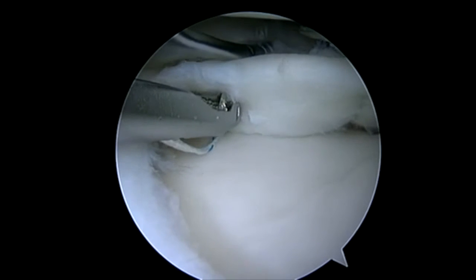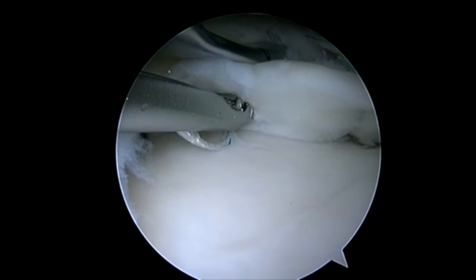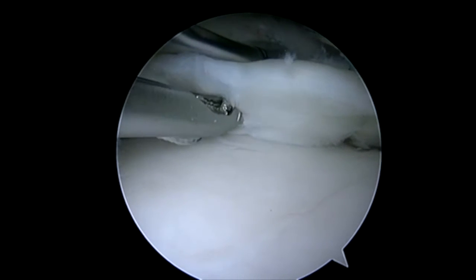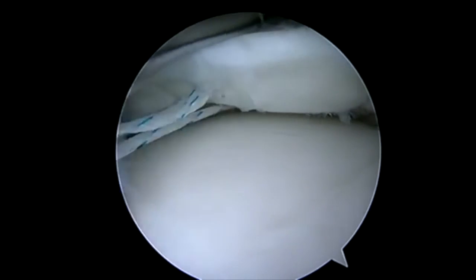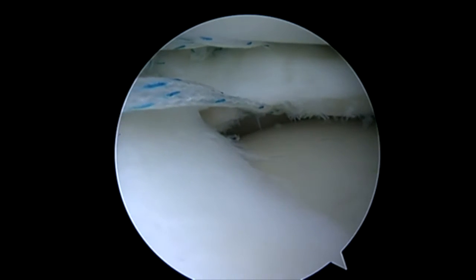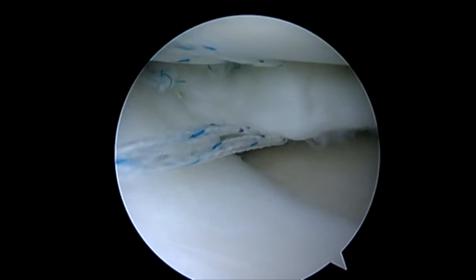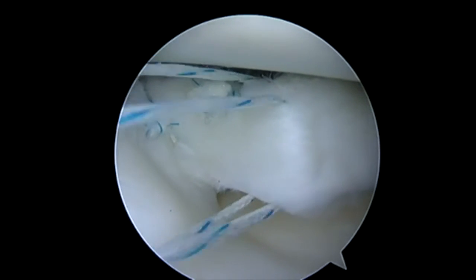I pass and tie each suture as I go. On this repair, sometimes I'll pass and use the initial suture as a traction suture. But in this case, the tear was just lined up very nicely and didn't require any extra manipulation of the meniscus to get it to line up. So you can see I've passed our central stitch. Here we're going to go ahead and pull the loop in. I tie all of these with a modified Westin knot — that's a sliding, locking knot.